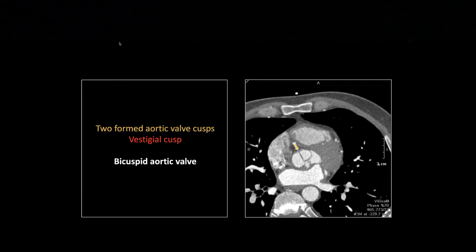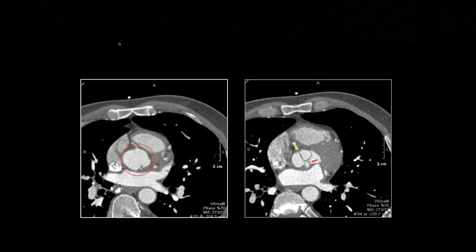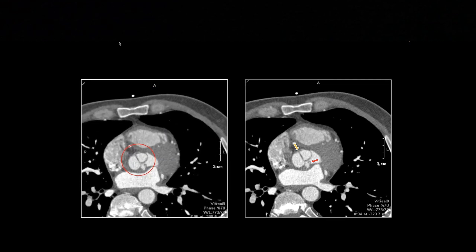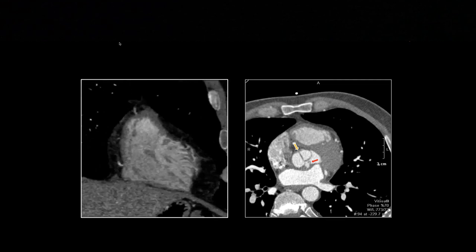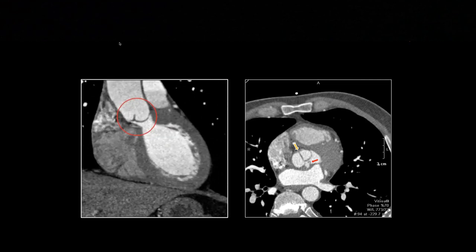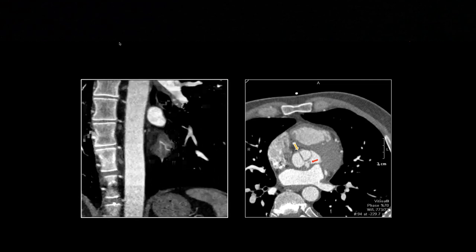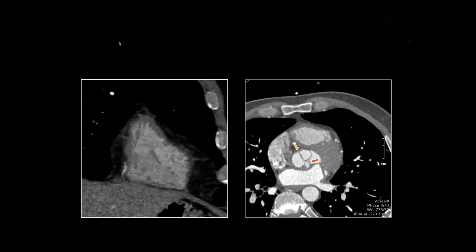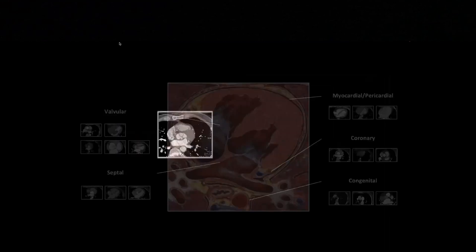This is just a bicuspid aortic valve. You can see the abnormal configuration — two relatively normal cusps, but one little vestigial cusp. That's common. Oftentimes the third cusp isn't completely absent; you'll see a hypoplastic vestige of what should have been the third cusp. These folks are at risk for coarctation and other congenital anomalies. The two dominant cusps are coapting fairly normally, and then there's that one little vestige. That is a bicuspid aortic valve.